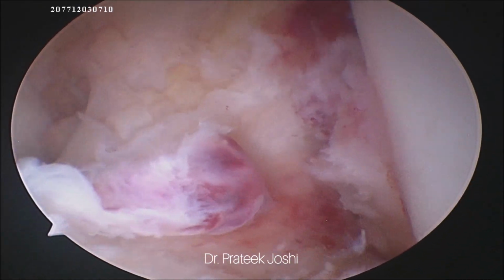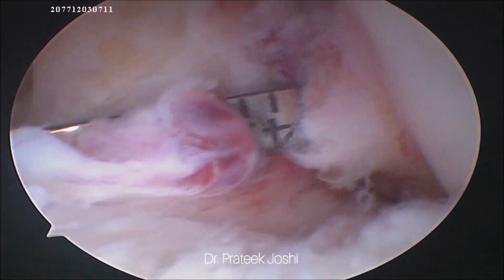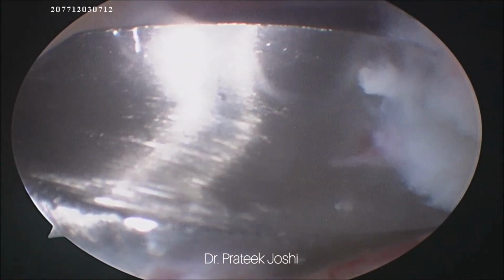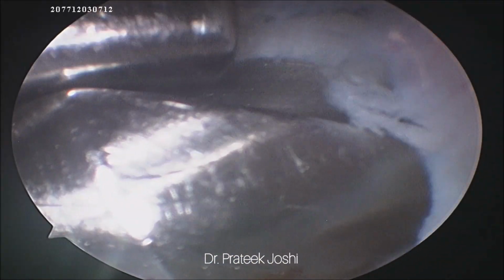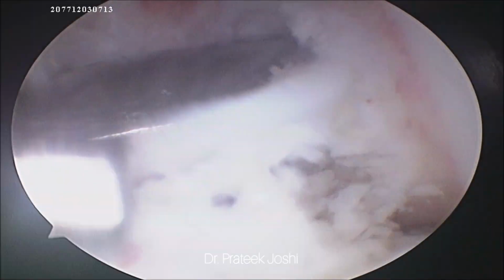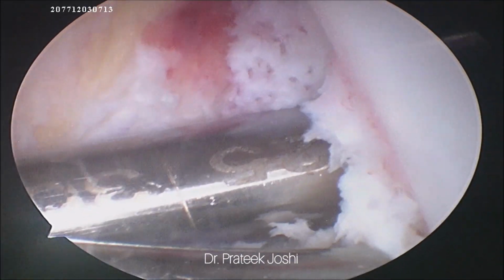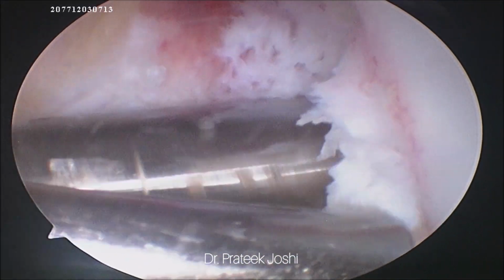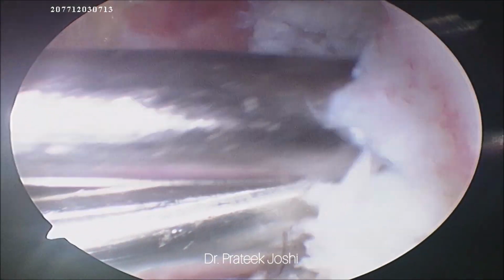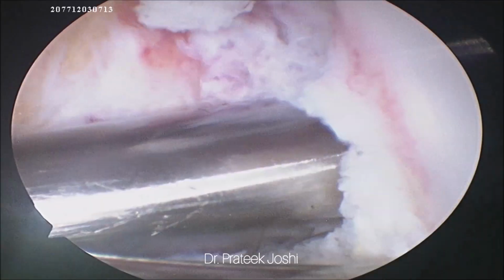Now I'm going to introduce the depth gauge from the anteromedial portal, and you can see that the length of our tunnel is 42 millimeter. So now I'm going to insert the guide wire through the lateral femoral condyle and drill with the 9 millimeter femoral drill bit because the diameter of our graft at the femoral end is 9 millimeter, and we are going to drill up to the mark of 30 millimeter because we intend to keep 20 millimeter of graft inside the tunnel, and 10 millimeter is the distance which we keep to facilitate the flipping of the endo button.